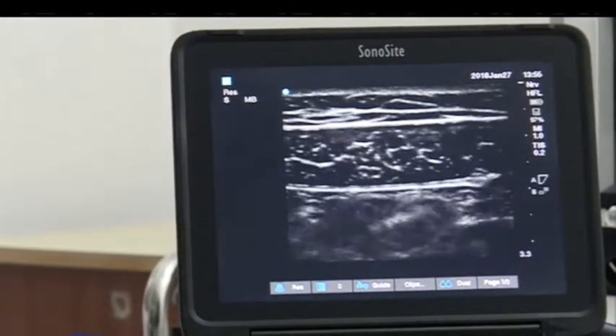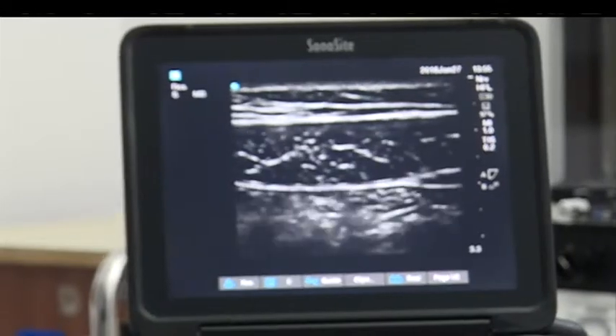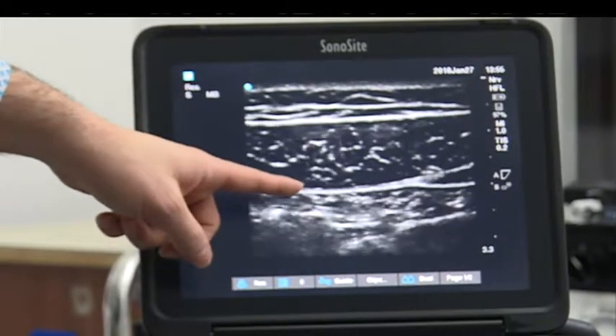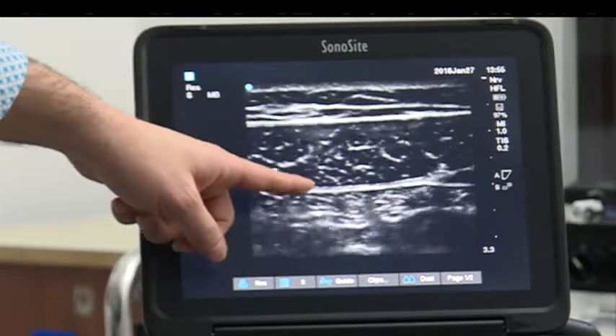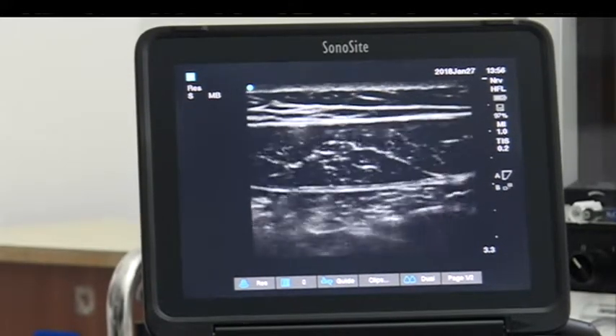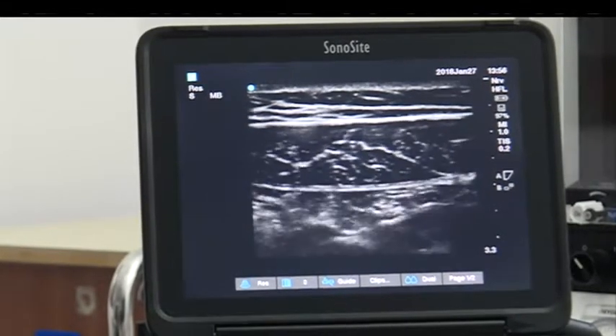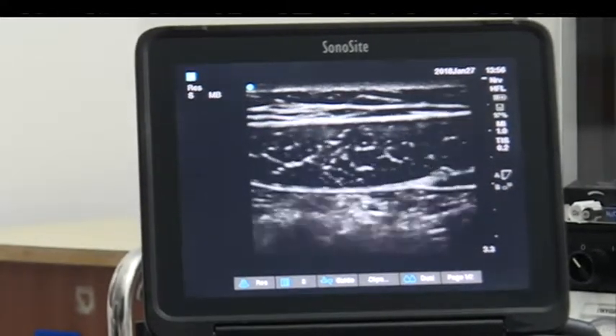For a rectus sheath block you want to be at the bottom of the muscle — not like a TAP block where you're between two layers — at the bottom of the muscle to lift it up. The lower layer is the peritoneum so you don't want to be through into the pre-peritoneal space; ideally you want to place it just there.